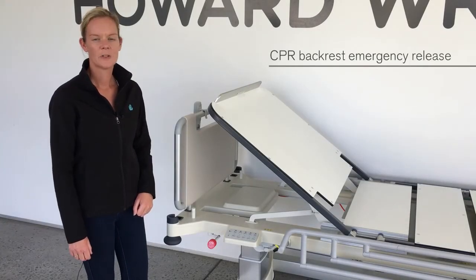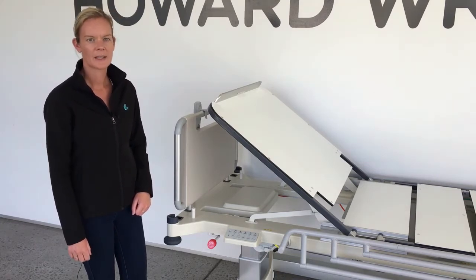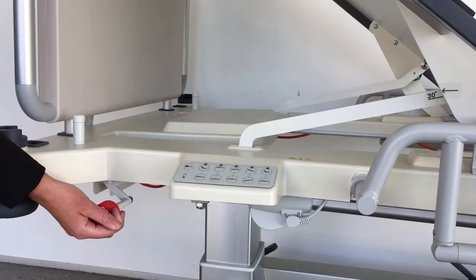A CPR backrest emergency release lever is located on each side of the bed. To lower the backrest quickly in an emergency, move the lever towards the head end of the bed.